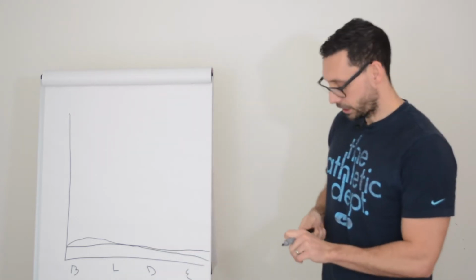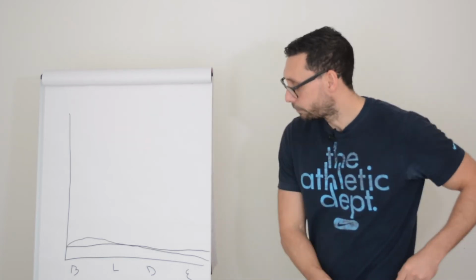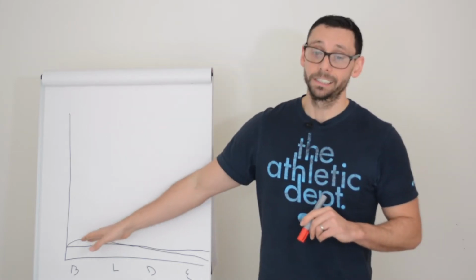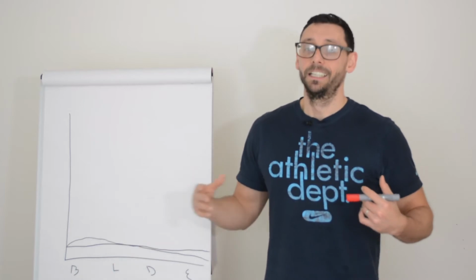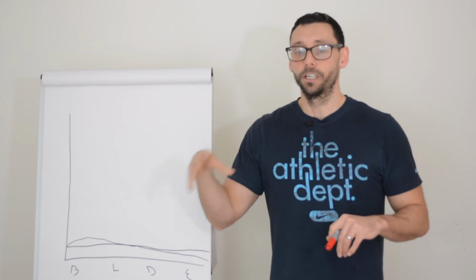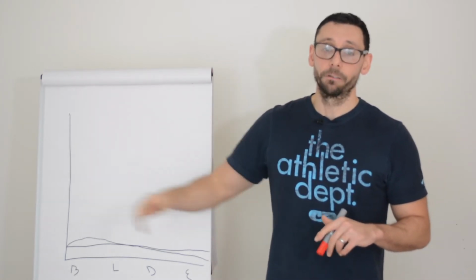Now, pump is slightly different in the sense that we can actually modify this basal rate throughout the day depending on what you're doing. So actually pump therapy doesn't use background insulin in the same format, so it won't use a long-acting insulin. It uses rapid insulin all the time, but the rapid insulin is dropped in using micro doses every minute to achieve that background coverage.